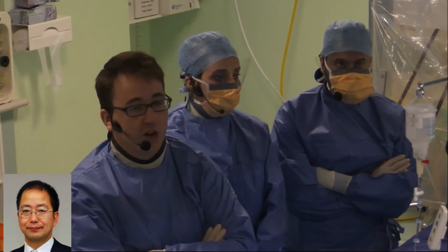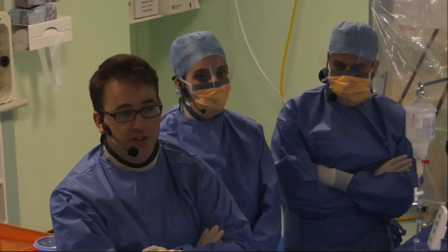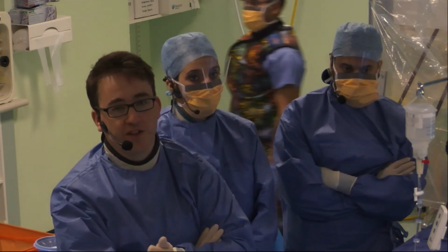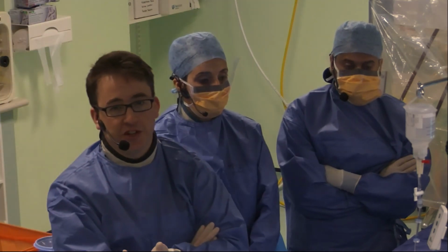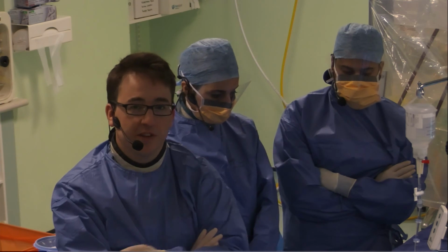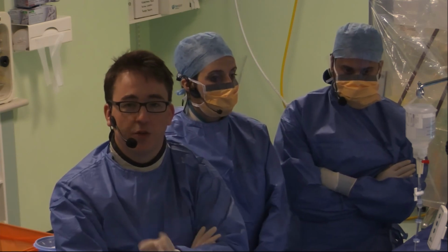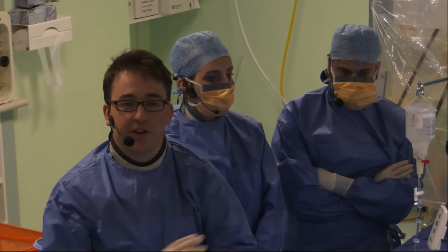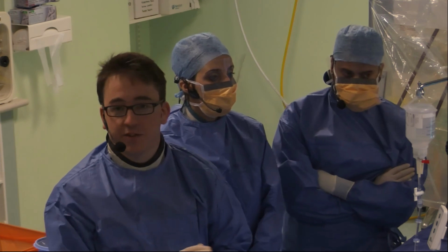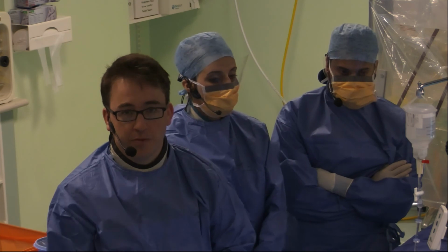No problem, Hitoshi. So, I think that we've demonstrated today the use of physiology nicely. And indeed, I think this is the important way how physiology is going to be used in the future. Previously, we would have had cases where there was multi-vessel disease, and you would have jumped in and stented all three vessels, and you would have had no kind of regard for the underlying physiology. Quite clearly here you can say that two of these vessels are completely normal and one is likely to be causing all of the problems here.